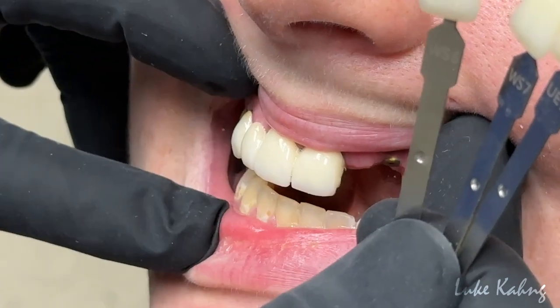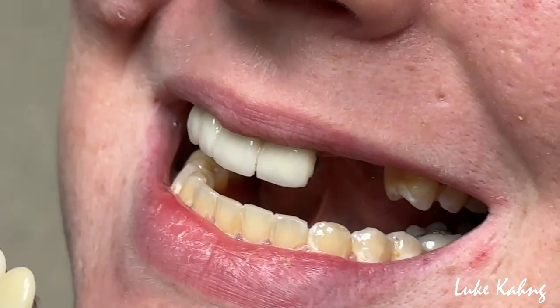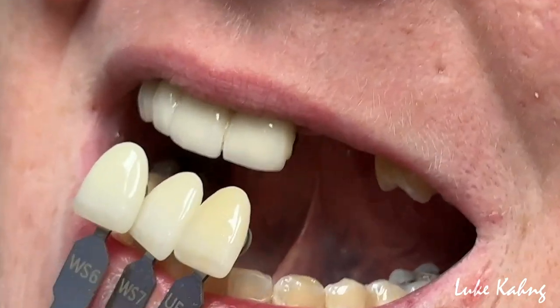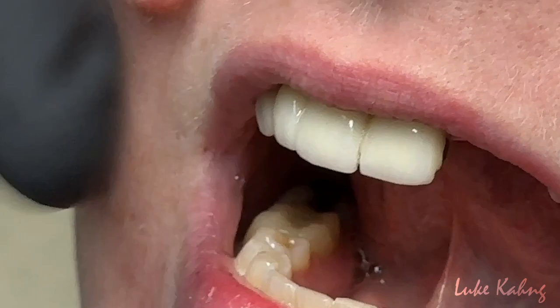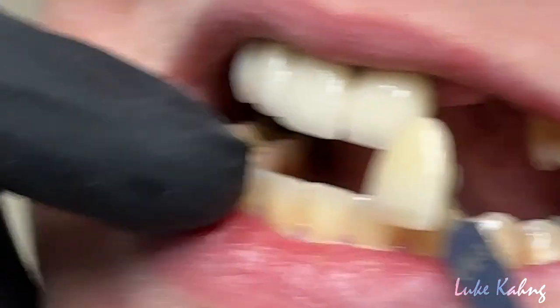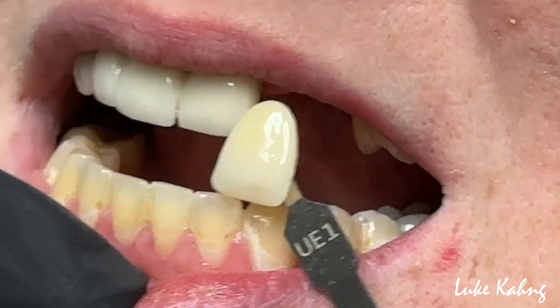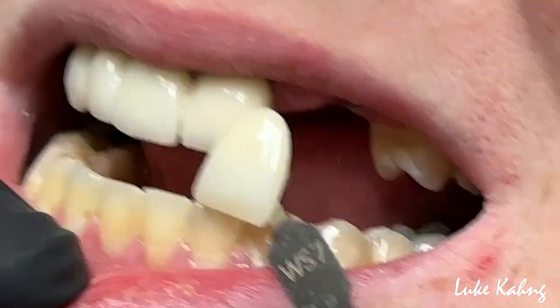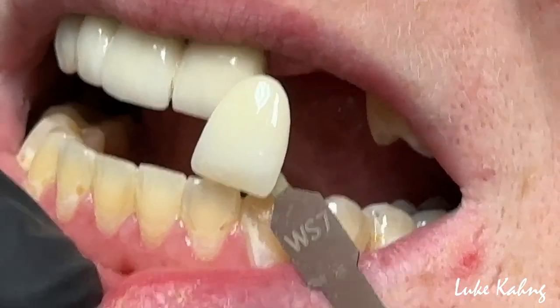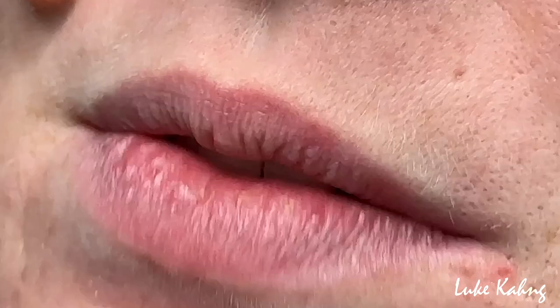Your teeth are lighter than the other side. So we have a zirconia — I will show you the shade tab so you can see. Kind of like this, right? Yeah. Like this — yeah, maybe that's closer. Somewhere in between there would be perfect.